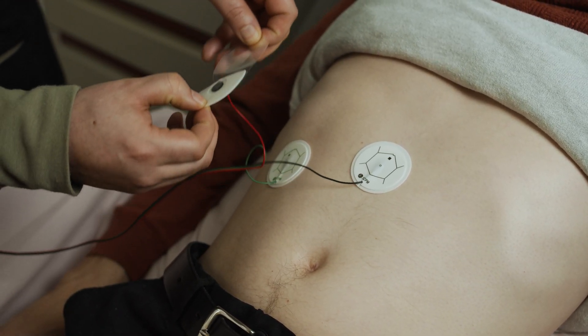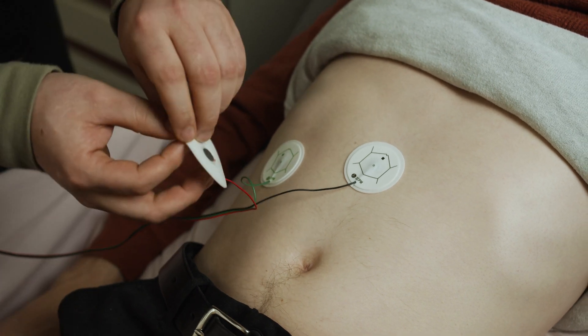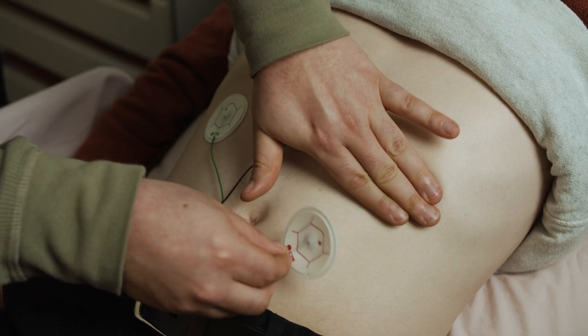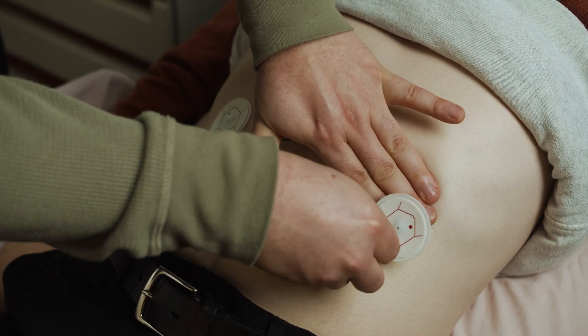The red pad will go mid-clavicular on the left side, at the bottom rib, two inches below the bottom rib.